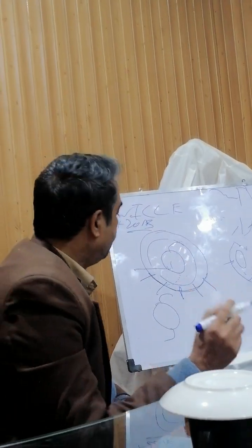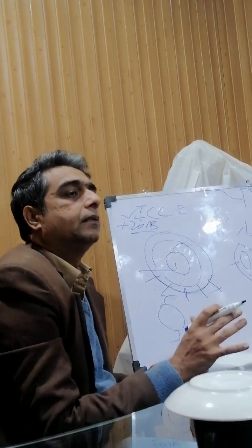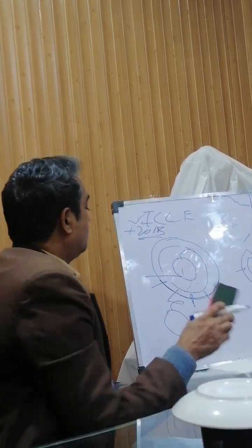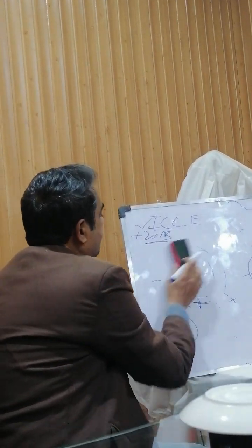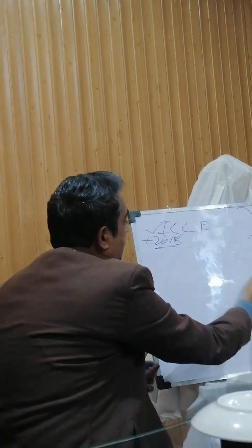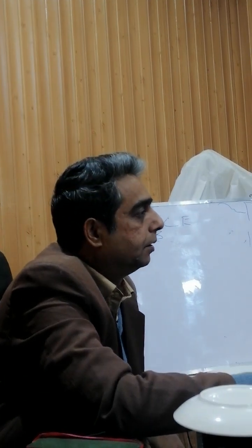After 40 days are complete, we take all the sutures off. After 40 days, the cornea attains its normal position, and the patient ideally should become 6 by 6. So this large incision and the problem of astigmatism is the basic problem which led ophthalmologists to think about and invent another procedure in which these issues are addressed during surgery.